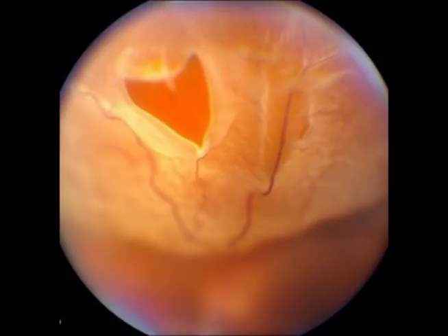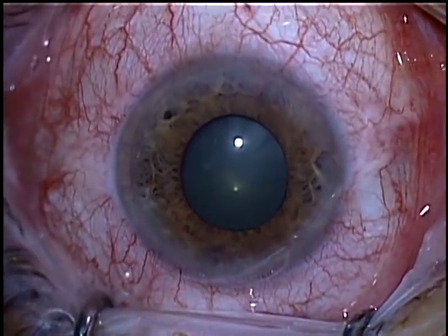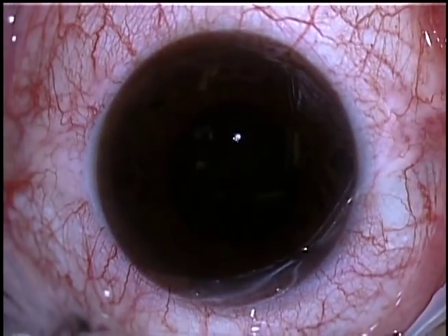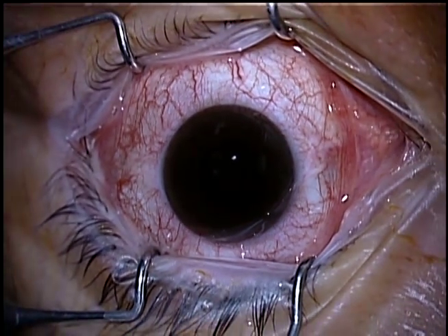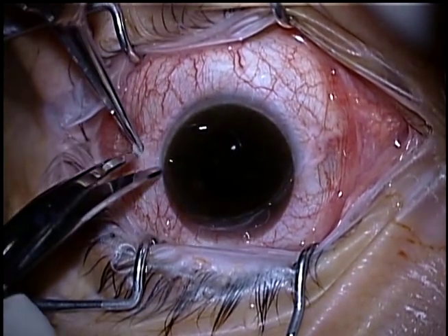Here is a photograph of detached retina associated with a horseshoe-shaped tear. This eye is being prepared for surgery with surgical scrub and drapes to reduce the risk of infection. This eye has a natural lens which you can see as an opalescent grayness in the pupil. This is part of the reason scleral buckle was opted to repair the detachment, so as to reduce the risk of cataract formation, which is more common in vitrectomy repair. The black spot on the camera image is a light shield to protect the retina from the operating microscope light.